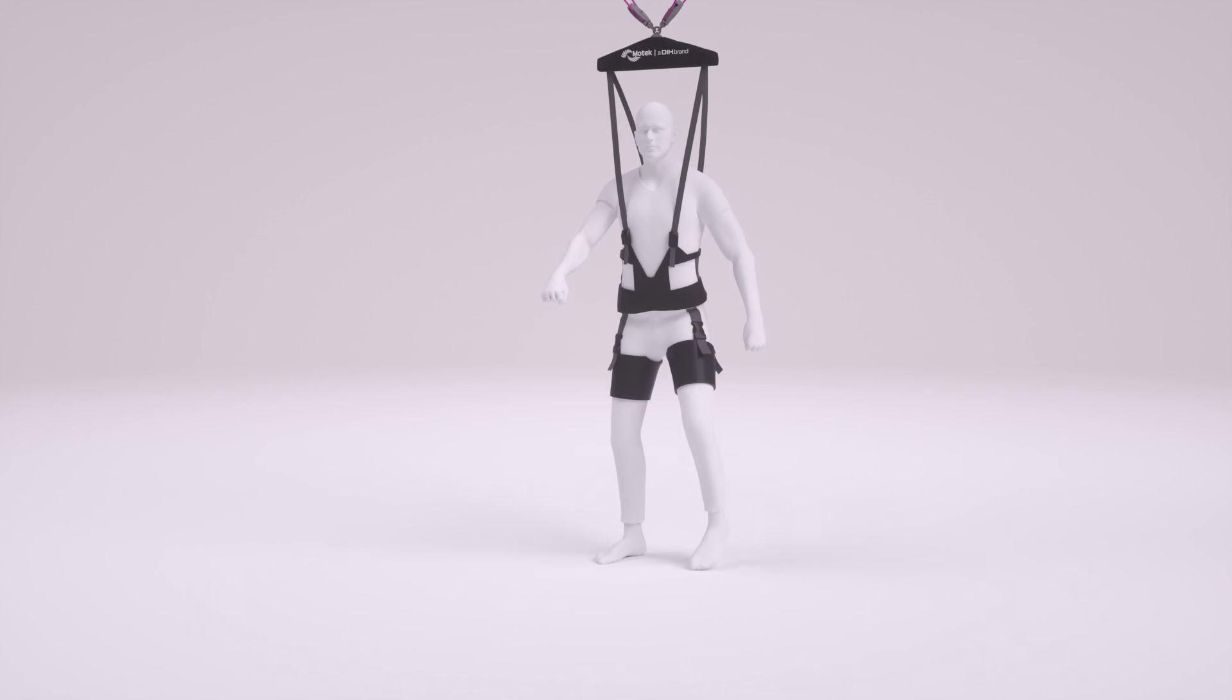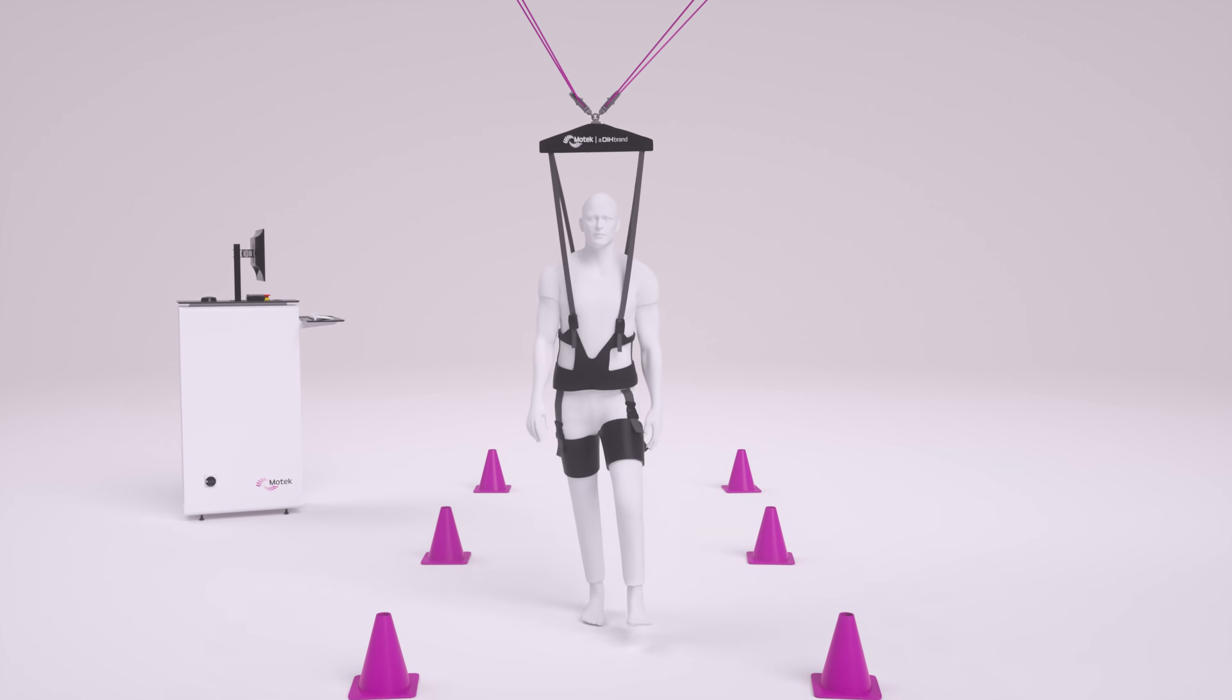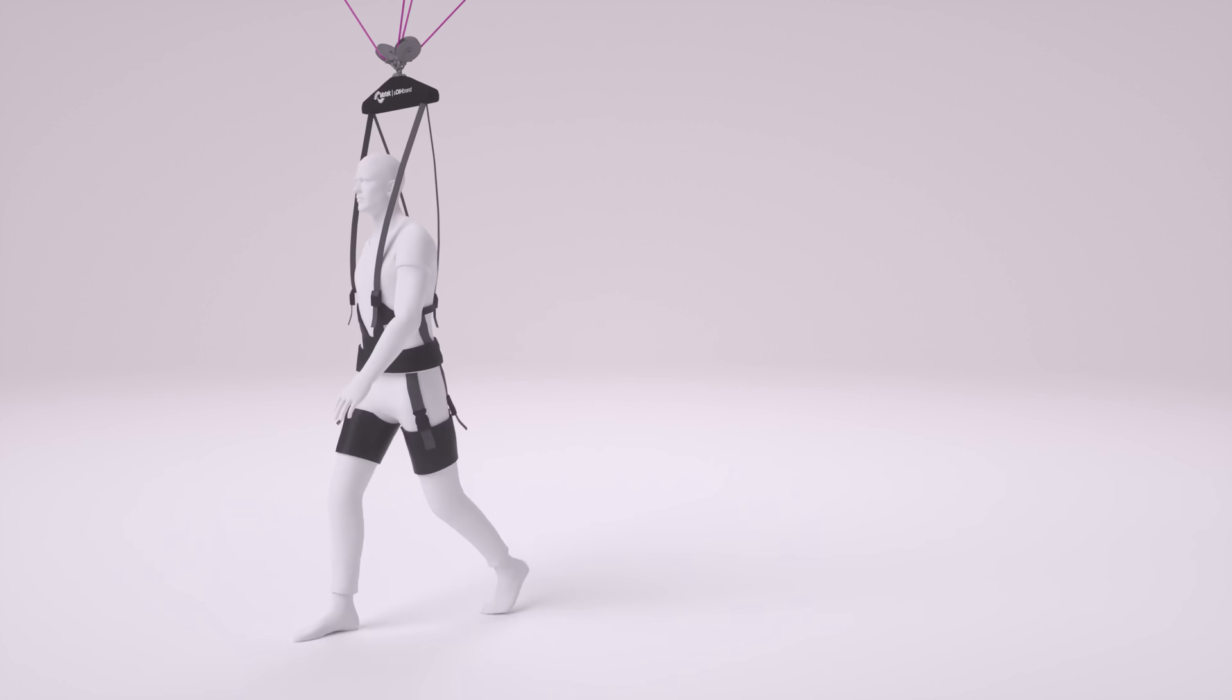It offers automatic fall detection, virtual walls to restrict involuntary movement, and of course manual stops.